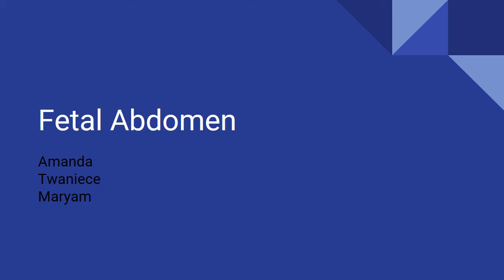This video is a tutorial on how to identify and document the fetal abdomen with ultrasound and what are the required landmarks that you need to show when you are measuring the abdomen.